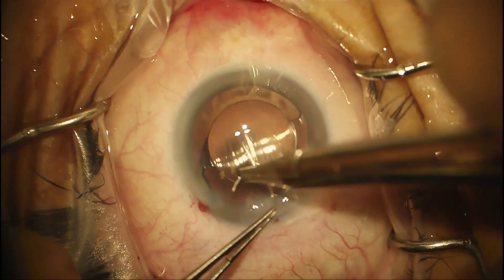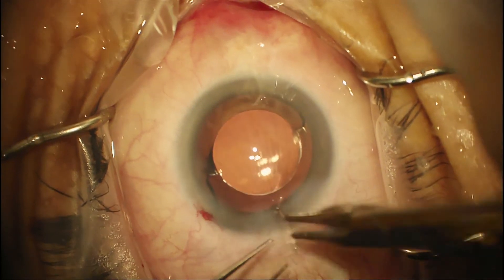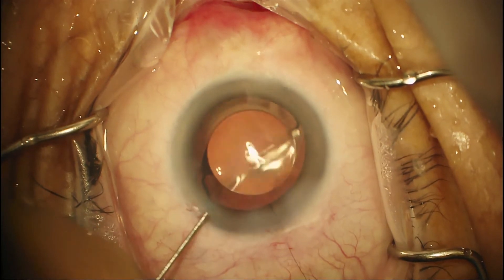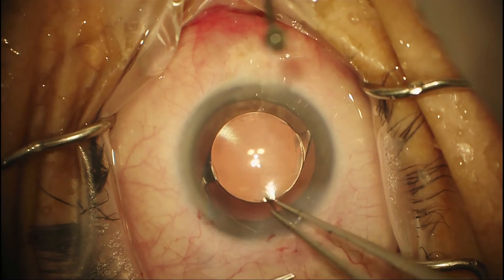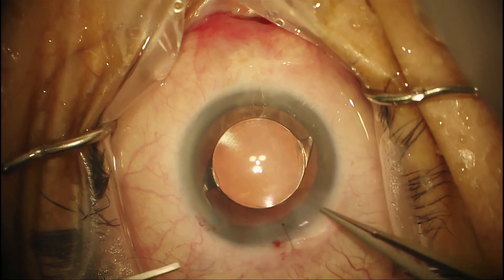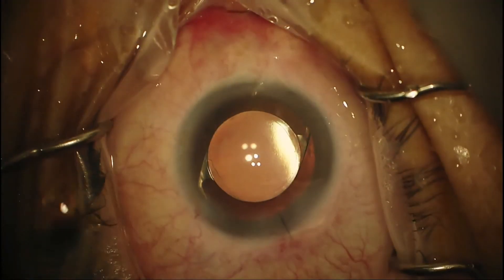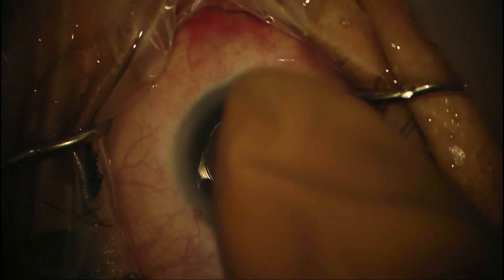I thought the case was over, but apparently the wound was leaking. So the decision was made to put in a suture. I'm quick to do this if I can't get that wound to close with stromal hydration. It'll just be a 10-0 nylon passed through the wound with a 3-1-1 closure — that helps you sleep well the night after surgery, so peace of mind is worth it. Rotate the knot, bury it, then re-center the lens. We want to verify that we have good pressure — and now I think we're done.